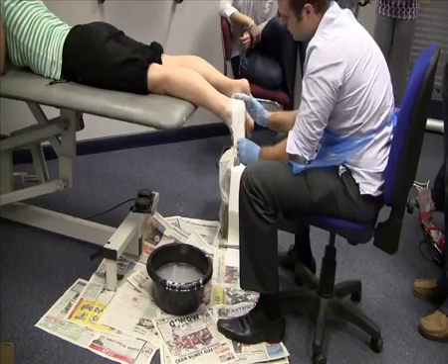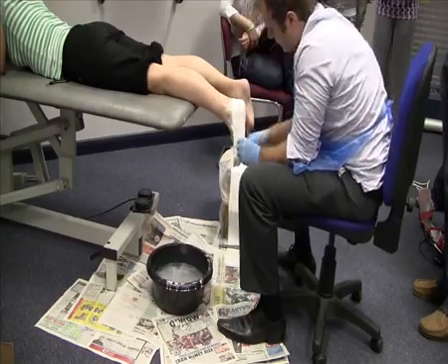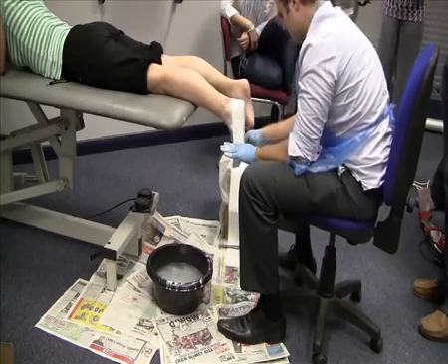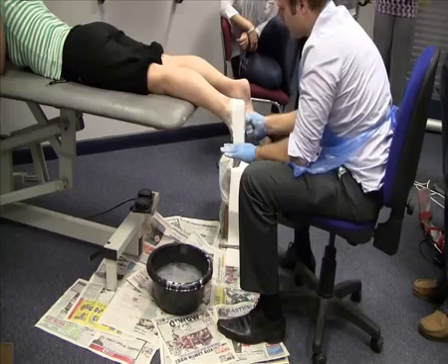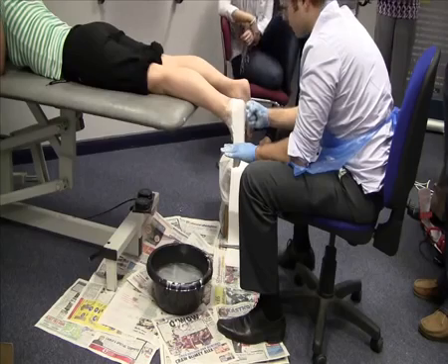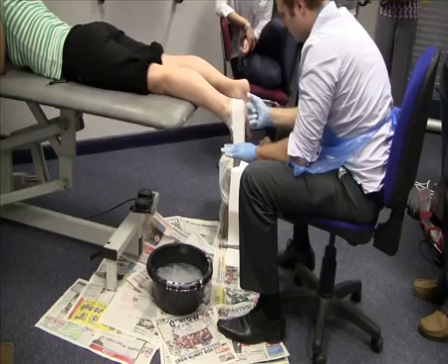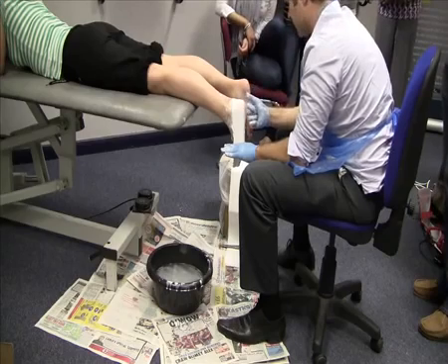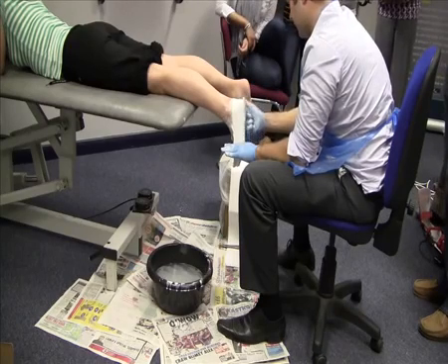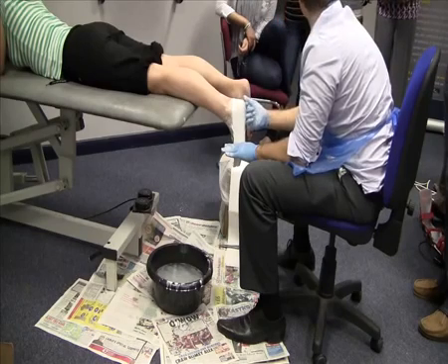I don't think the water, it's fairly warm, so it shouldn't take too long to dry. Once you get to a certain point, you can just leave it or hold that position. We're not at that point yet. You can tell it loses that shiny appearance, and when you flick it, it starts to sound hollow. Some plasters dry quicker than others.